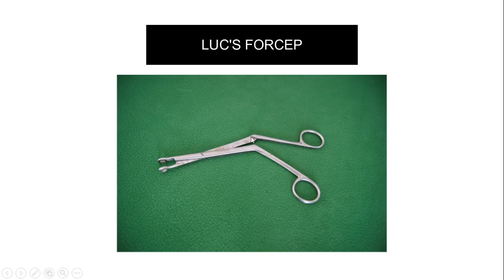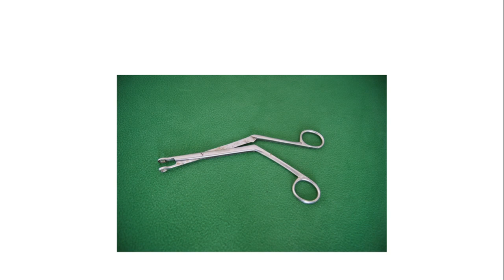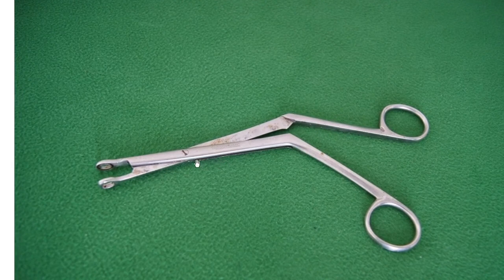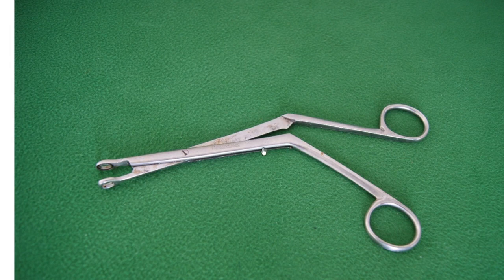This is the Luc's forceps, which should be differentiated from the tonsil-holding forceps and the Blakesley forceps. The tonsil-holding forceps has a blunt end, but the Luc's forceps has a sharp end because it is used for biopsy — to cut tissue. The most important difference is that when you close the Luc's forceps, this end goes inside — there is a slit — so tissue enters inside. With tonsil-holding forceps, the parts come together but tissue does not enter inside in the same way.